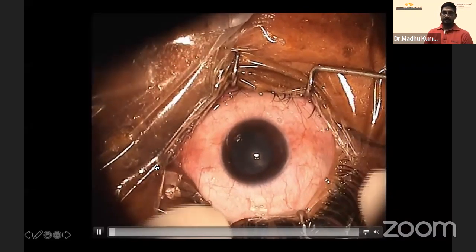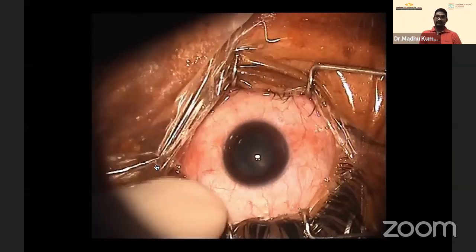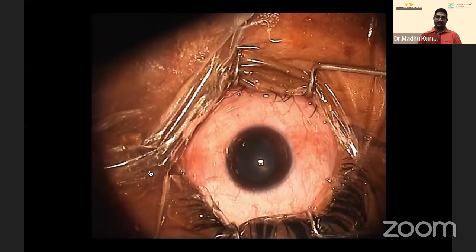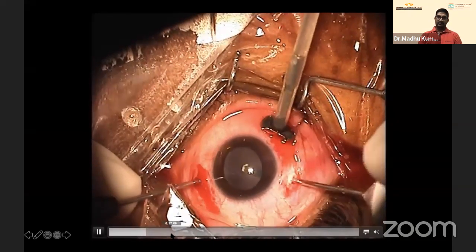Given the metallic nature of the foreign body, removal with a magnet was planned. Vitrectomy was done first — debulking of the vitreous — and the foreign body was identified in the vitreous cavity.